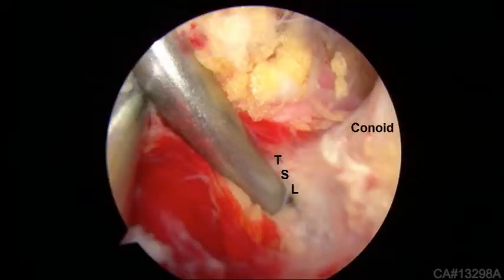Here is typical anatomy that is encountered. The transverse scapular ligament is seen with the ASTL in the notch. The suprascapular nerve and artery are protected medially. Note how the conoid ligament transitions seamlessly into the TSL — this is very reproducible anatomy.